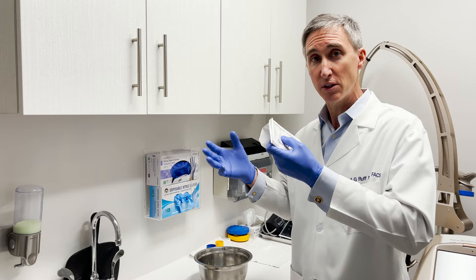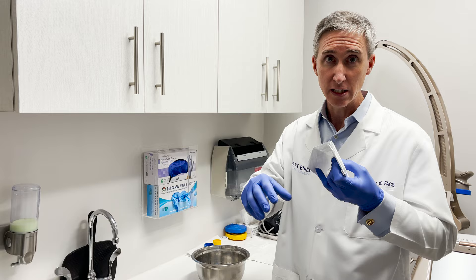From gloves to air to skin, as much as possible, we can reduce contact as much as possible, which makes it even more safe with less potential for contamination.